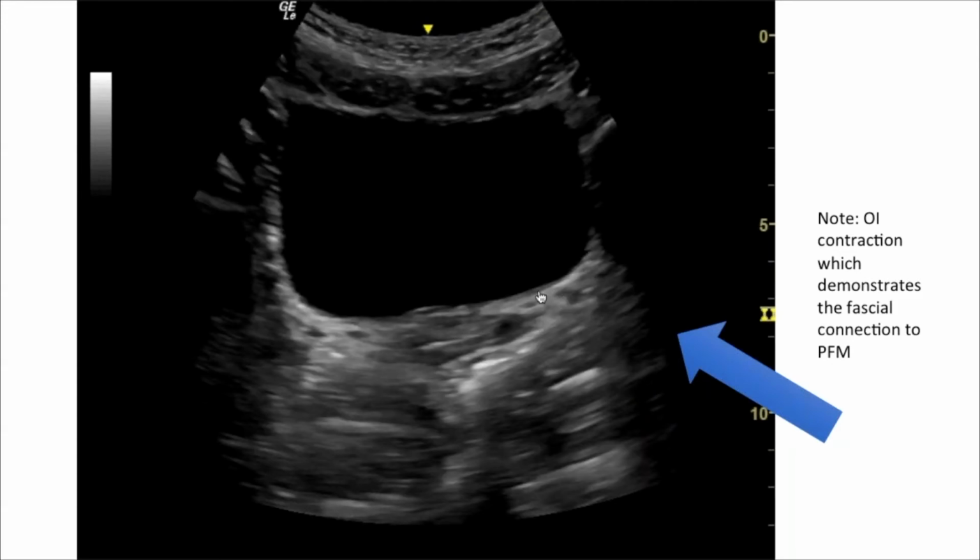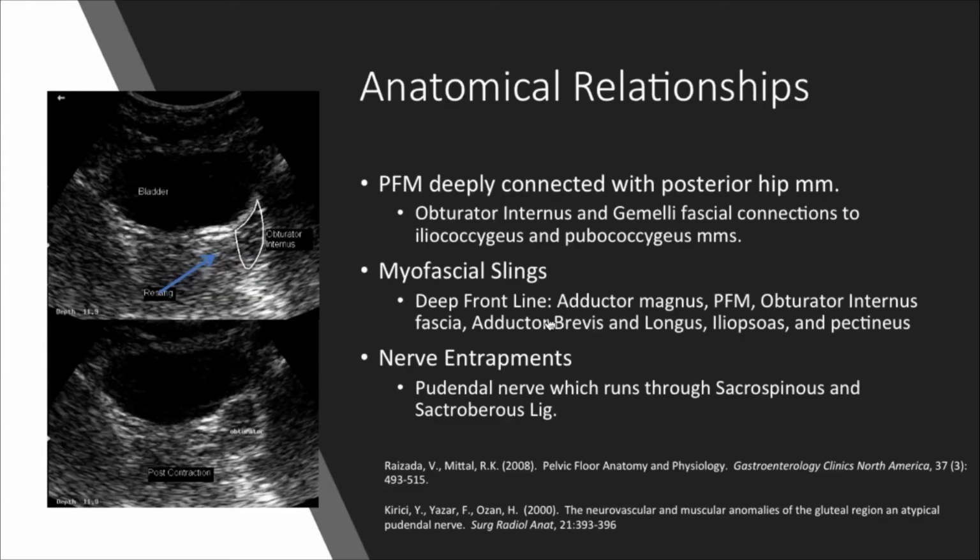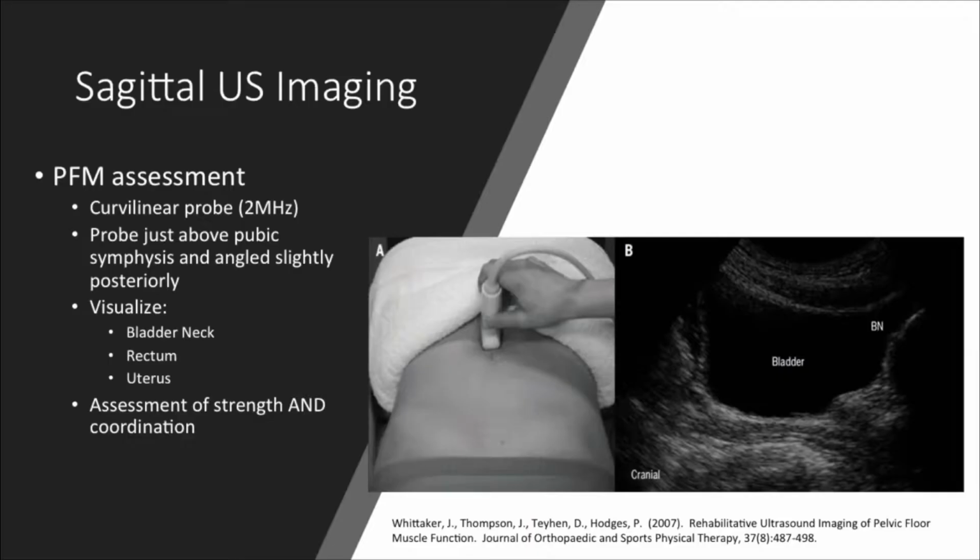You might also see with a very hypertonic obturator muscle, as we see in this image here, a change in even how your bladder looks. So it can even show a difference in the shape of the bladder. So if you put your transducer on this individual and you already see a change in the view of your bladder, you can start to understand, is there a hip rotator component to why they can't contract their pelvic floor properly, and is this something that you can release manually before, say, you have to send them to a pelvic floor therapist.